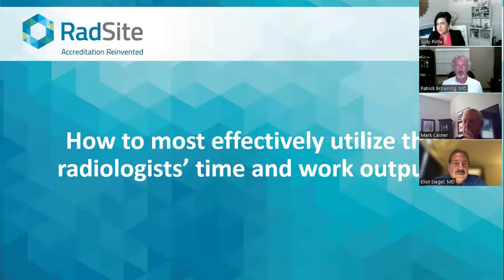And then as far as radiologist time, we've done a variety of different studies looking at how much of a radiologist's time, if a study takes X amount of time to interpret, is really spent with the radiologist looking at the images and making a determination of what she or he thinks about the diagnosis and findings, and how much of it is waiting for images to come up, waiting for them to be arranged, waiting for reporting systems to come up, and clicking a variety of different things that we have to. And so I think that there's still in 2022 tremendous potential to be able to rethink how we end up working in our work output.